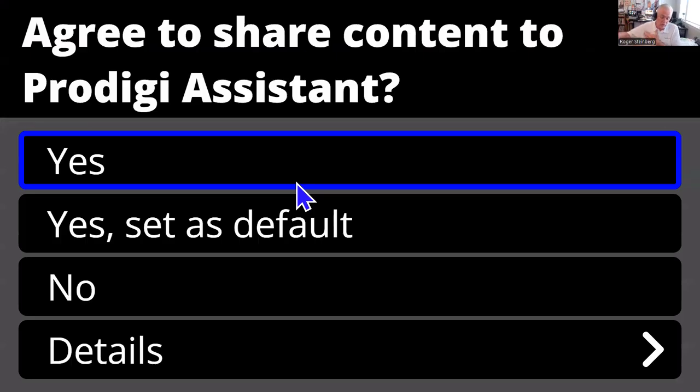We're going to send a picture of this to our cloud services. They're secure. We save nothing to it, but it interfaces with our AI model and sends a response back to you. And anything that you send to the cloud and we send back, ultimately, if you decide to save it, gets saved on your system and nothing is saved in the cloud. So that's one of the ways that we maintain security. We're not sharing anything with the outside world.